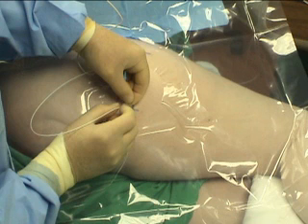If the twitches disappear, as in this illustration, the catheter is carefully withdrawn to inside the shaft of the needle again, such that the entire broad black mark is visible again. Make a small adjustment to the needle by rotating it 1/4 turn clockwise or counterclockwise, or by withdrawing or advancing the needle slightly and advance the catheter again.